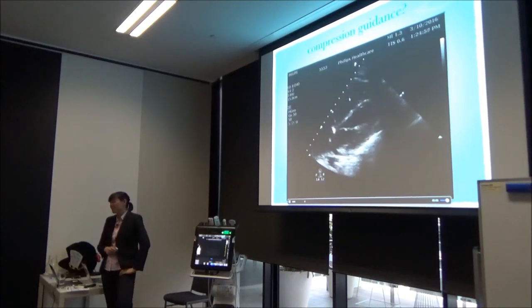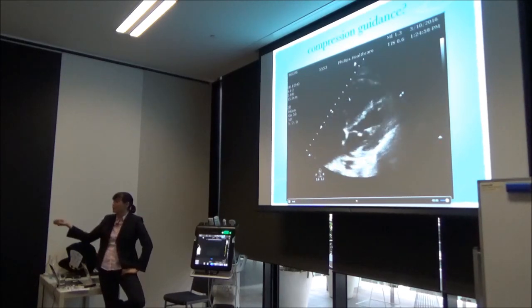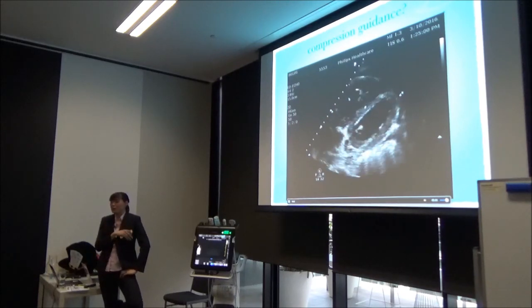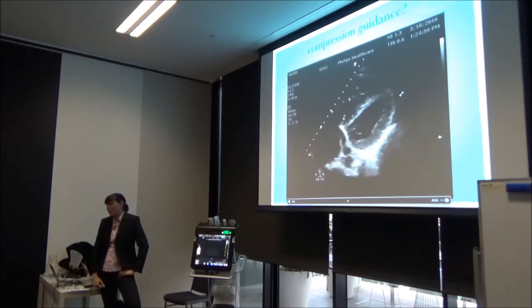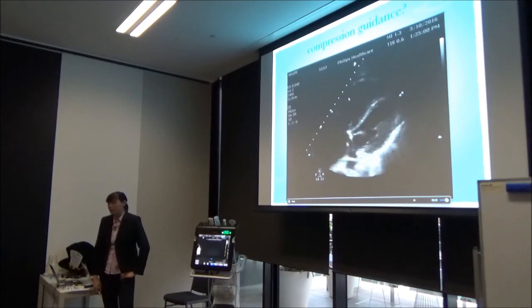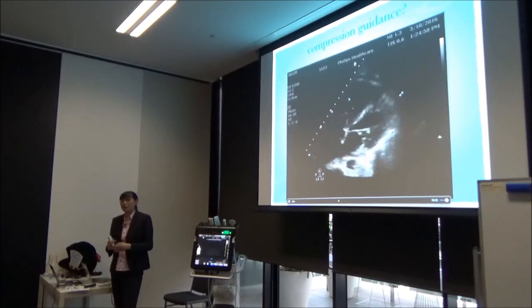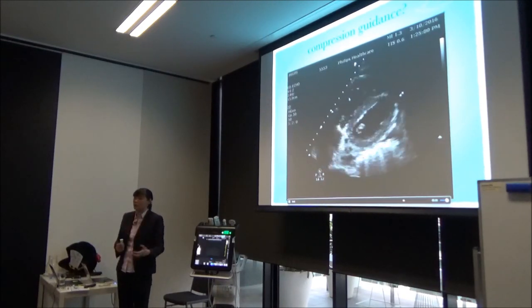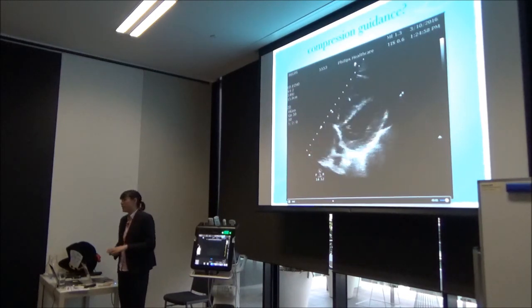Is this easy to do? It's not really. This is the whole reason why Lindsay had this whole TOE talk, because you can't really do this in everyone. But I'm advocating for it more and more because we're not improving our ROSC outcomes, especially for out-of-hospital cardiac arrest. There's something that needs to change with the mechanisms that we currently have, and most of us don't have TOE at the moment. Establishing a TOE program would probably cost about $200,000.